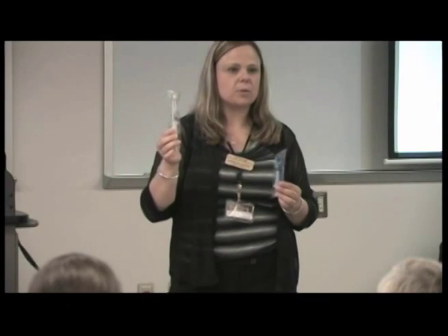Okay? I can't imagine that you guys are going to be doing heparin, but I just want you to be aware that in the hospital environment, they do have heparin flushes and they have saline flushes. It's going to be based off the hospital policy on what they use on the devices.